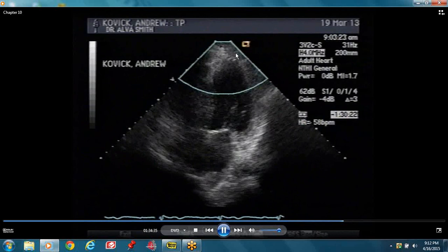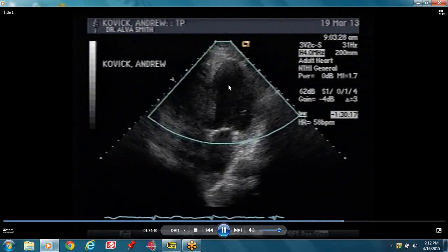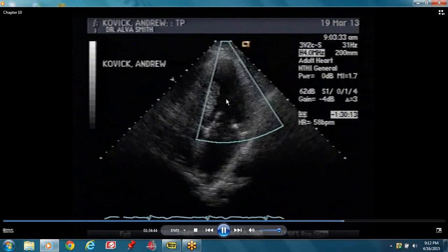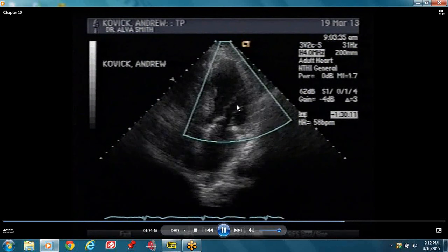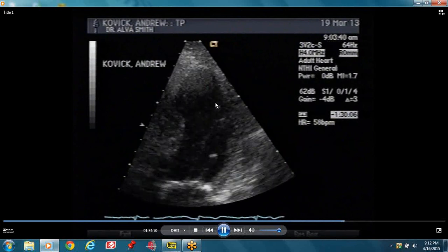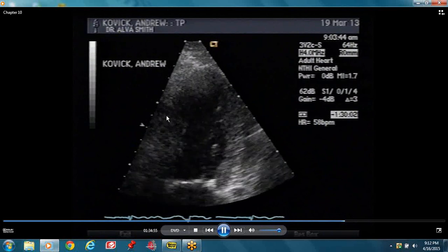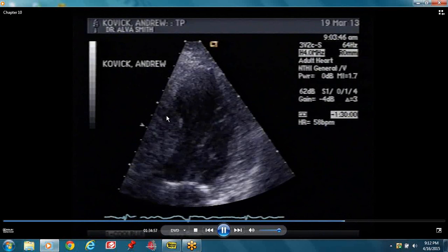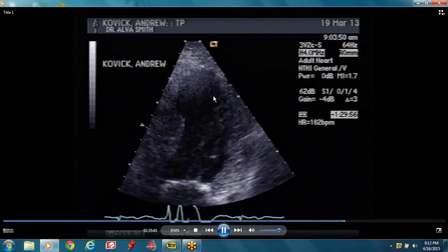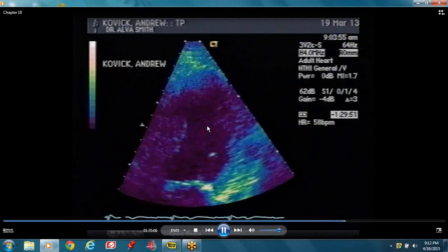You have to look carefully in this area to make sure there's no blood clot there. The other areas are moving and thickening with contraction. This area is not moving. This is a ventricle that will form clots because it's not moving.